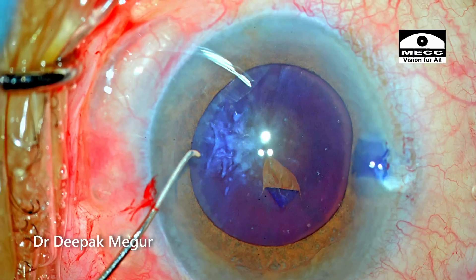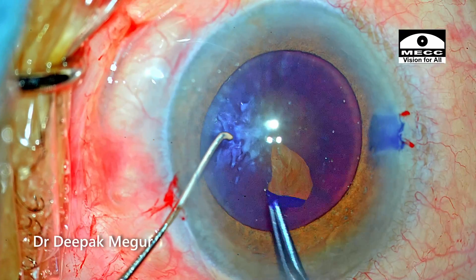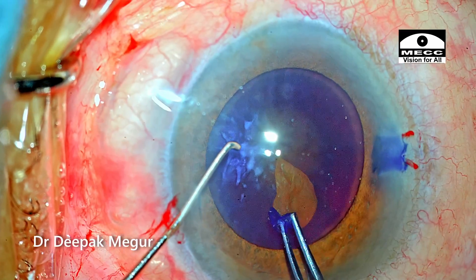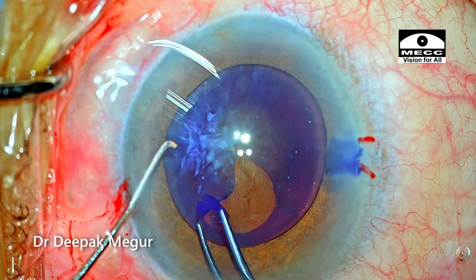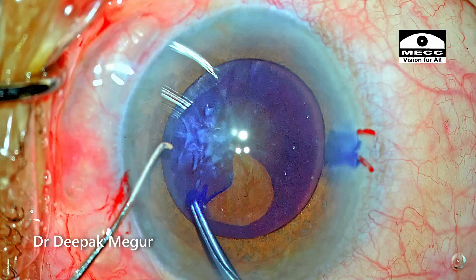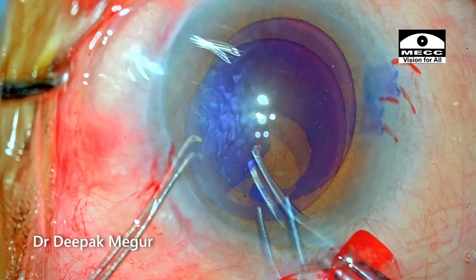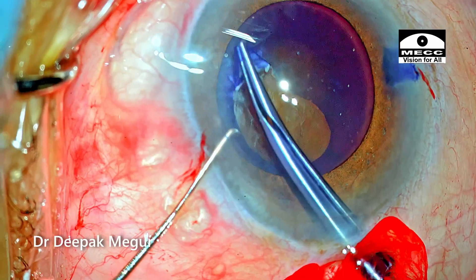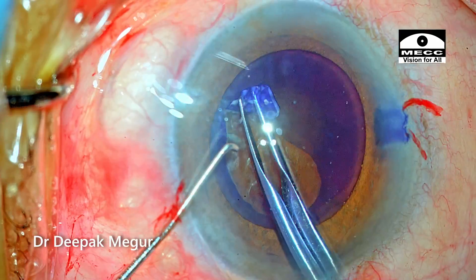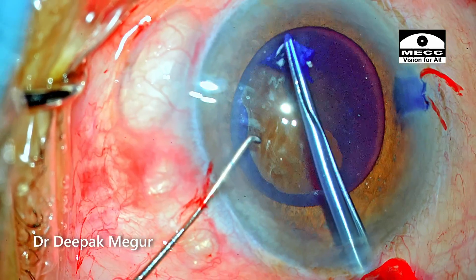I did not see any wrinkling of the anterior capsule, which suggests the zonules are in good health. My plan is to ensure that the rhexis is done around and slightly away from the calcified zone — I want to avoid it. My goal is to do the rhexis so that it encompasses and stays away from the calcified zone.